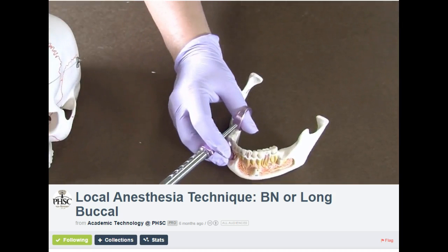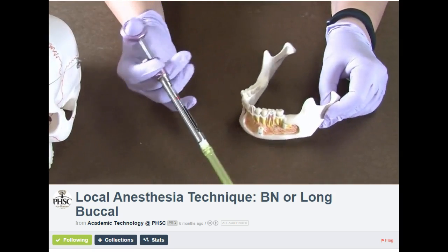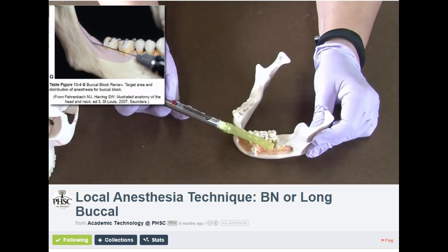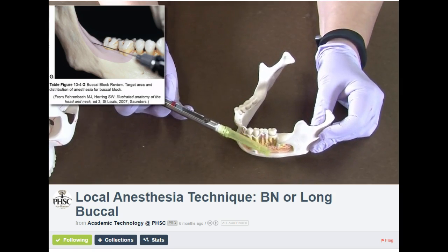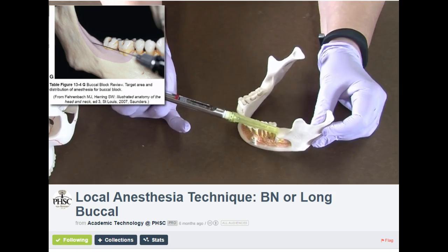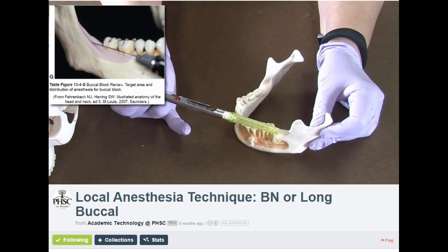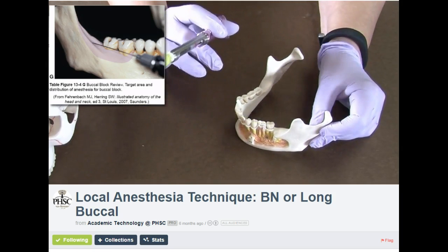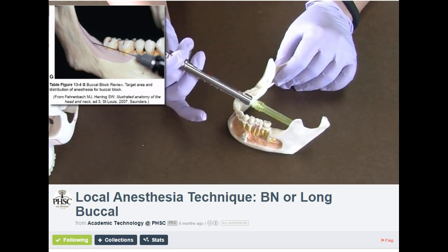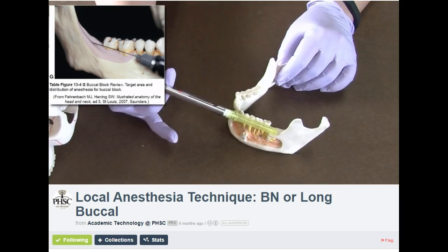The Long Buccal Nerve is the next one. Now the book recommends switching to a short needle for that, but I find that wasteful. Also, the more you change needles, the more chances you have of having a needle stick injury. So I just use my long needle that's already there, and I'm already in the vicinity, so I just come over to this side.